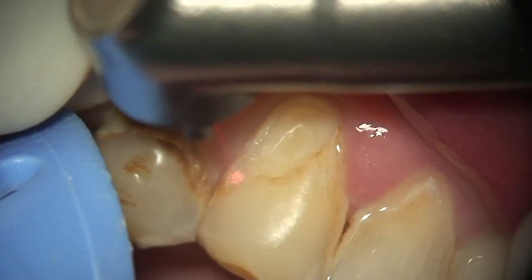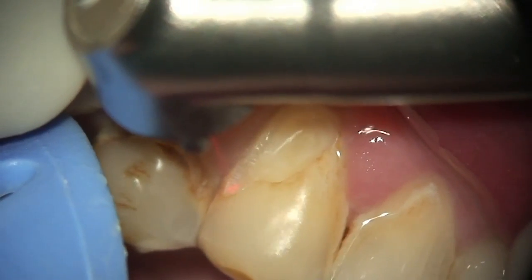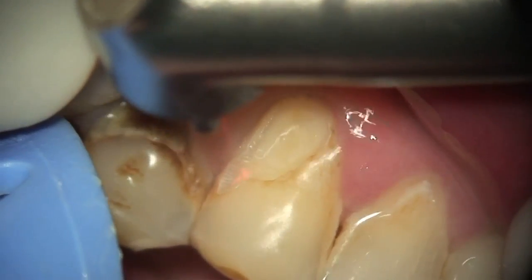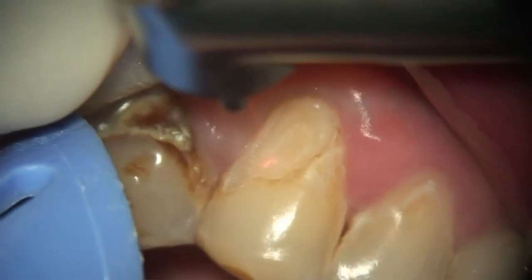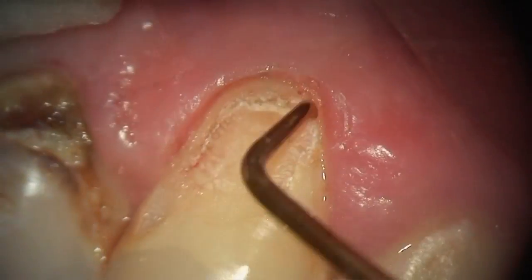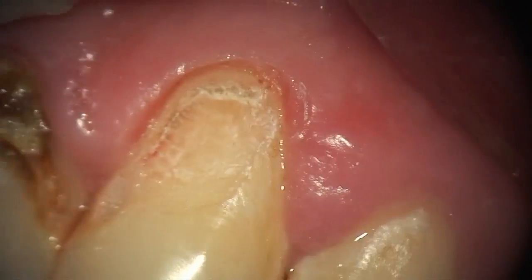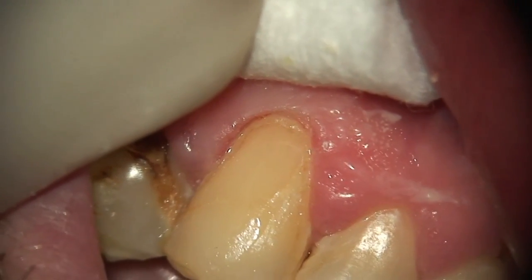These types of procedures, in actual time, take me maybe five to ten minutes per tooth at most. It's very simple, very easy, and the patient loves the fact that they're not numb and can go out and have lunch right after you're done with the filling.